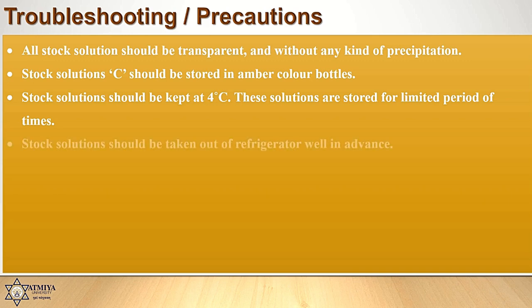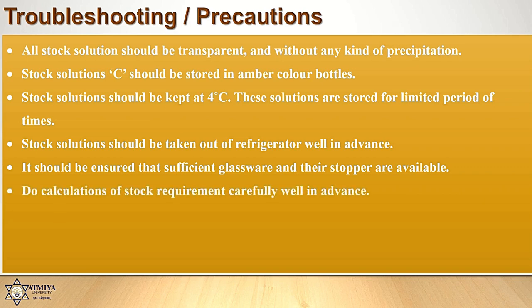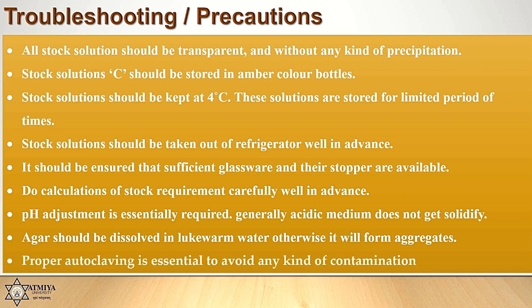Stock solutions should be taken out of the refrigerator well in advance. It should be ensured that sufficient glassware and their stoppers are available. Do calculations of stock requirement carefully well in advance. pH adjustment is essentially required. Generally, acidic medium does not solidify. Agar should be dissolved in lukewarm water, otherwise it will form aggregates. Proper autoclaving is essential to avoid any kind of contamination.